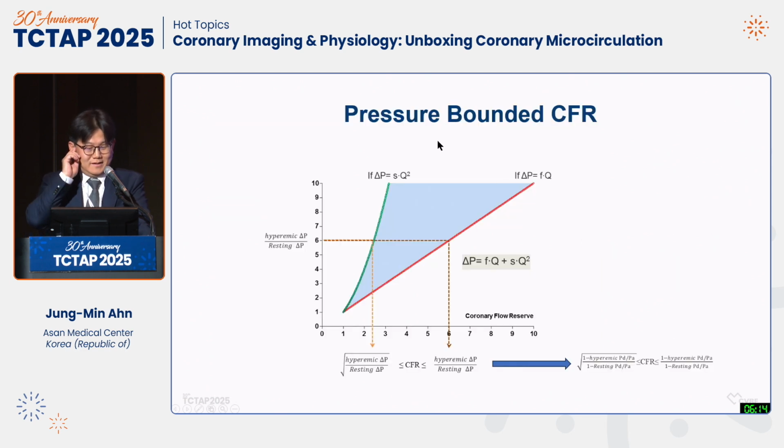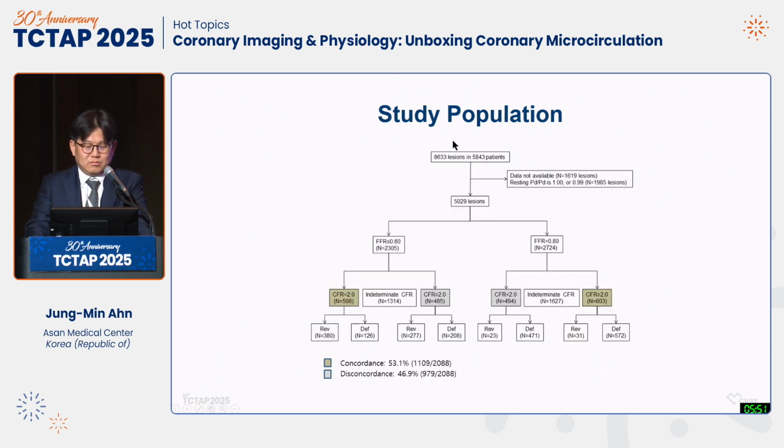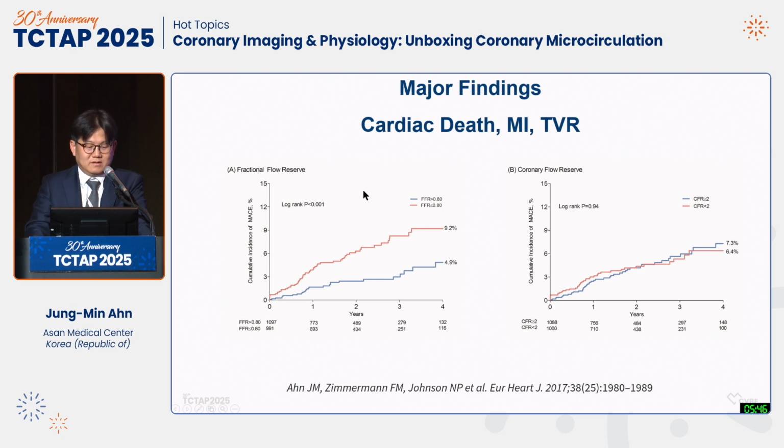So previously, Niels Johnson, Frederik Zimmermann, and I published one paper about the pressure-bounded CFR. According to the very conventional flow dynamic law, based on the pressure measurement, we thought we could guess the CFR boundary. So based on our large registry data, we evaluated like this.